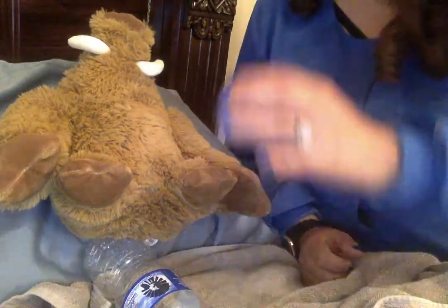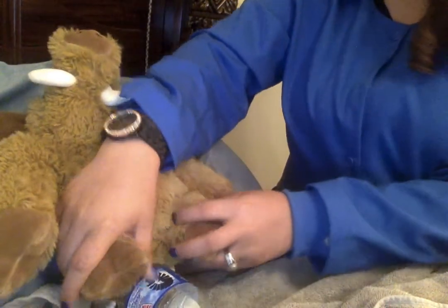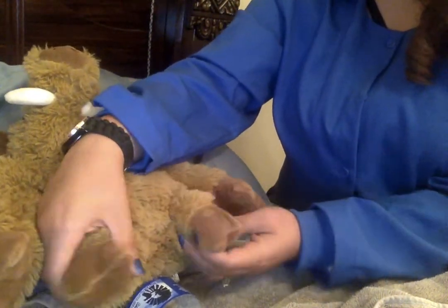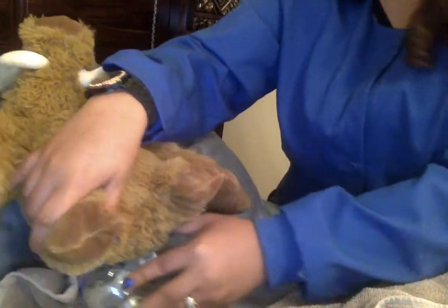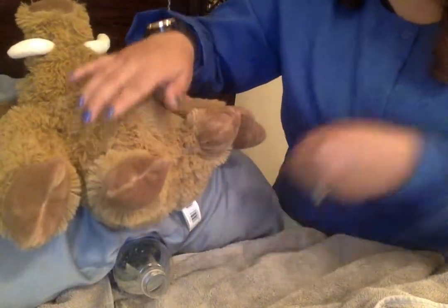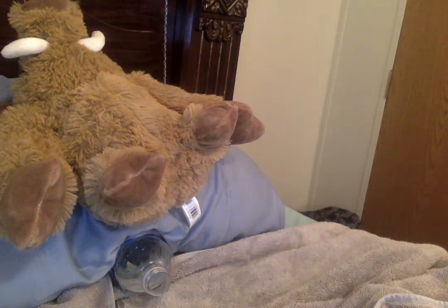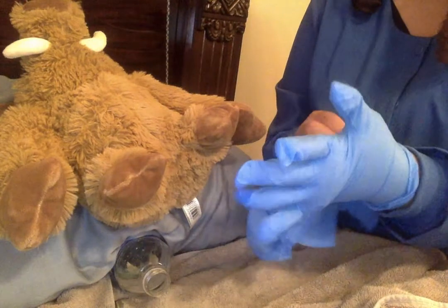We're going to position the patient. So since this patient is a female, we're going to have her on her back with her knees apart and her feet touching. Since she has short legs, they're going to stay like that. So now we're going to apply clean gloves.